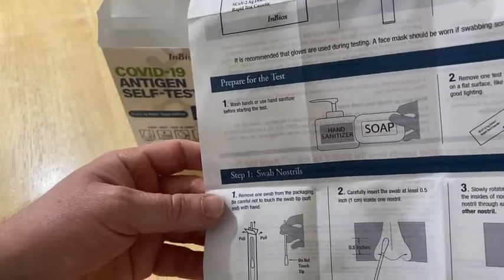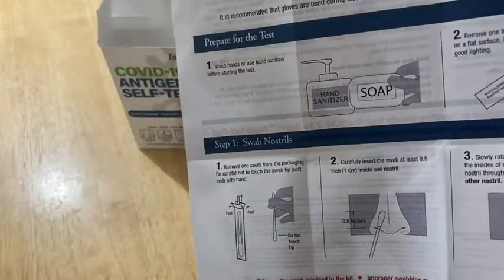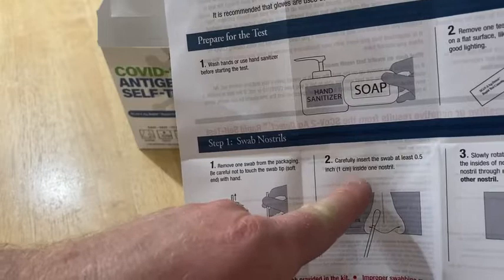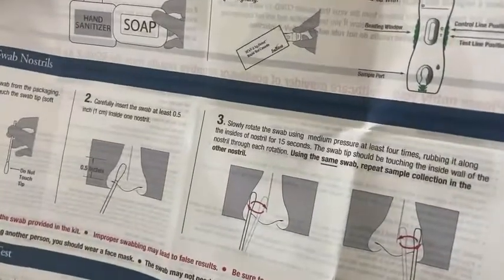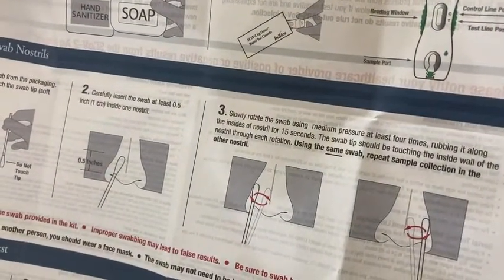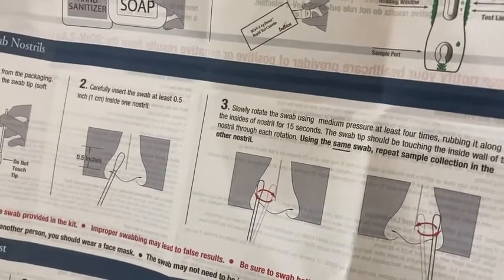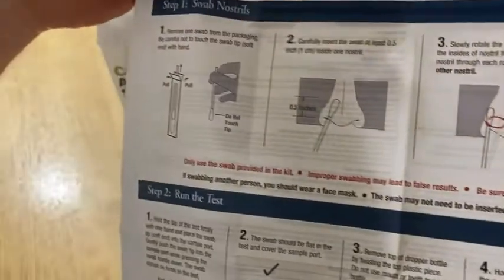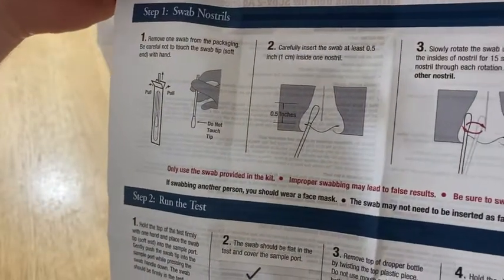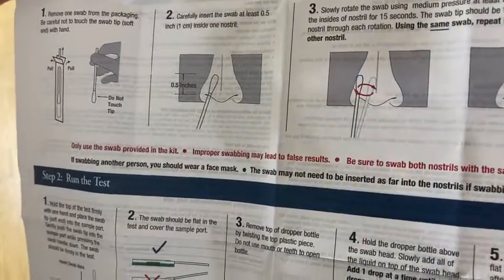Remove one swab from the packaging, be careful not to touch the swab tip — the soft end — with your hand. Carefully insert it at least 0.5 inches inside one nostril, then slowly rotate the swab using medium pressure at least four times, rubbing it along the insides of the nostril for 15 seconds. The swab tip should be touching the inside of the nostril through each rotation. Using the same swab, repeat sample collection in the other nostril. You should only use the swab in the kit — improper swabbing may lead to false results. Be sure to swab both nostrils with the same swab.